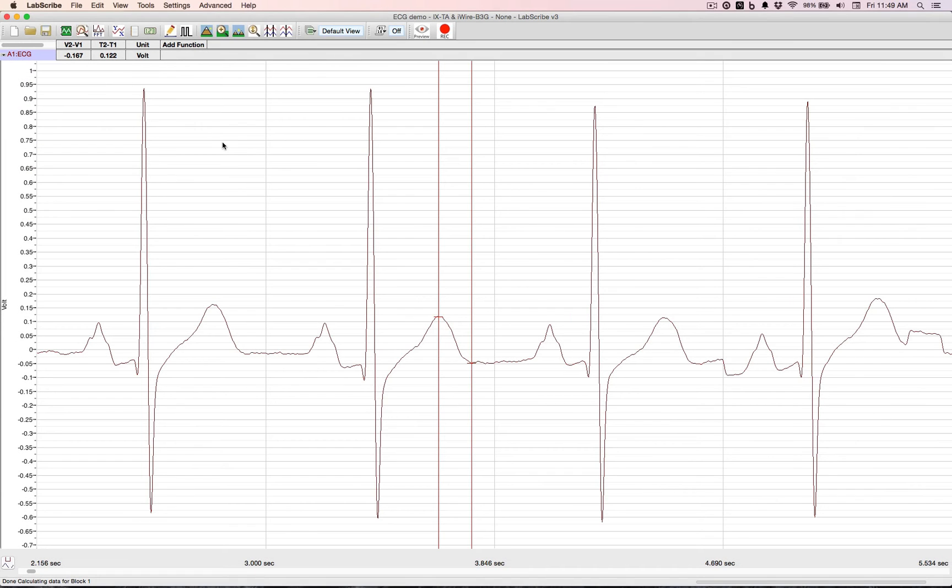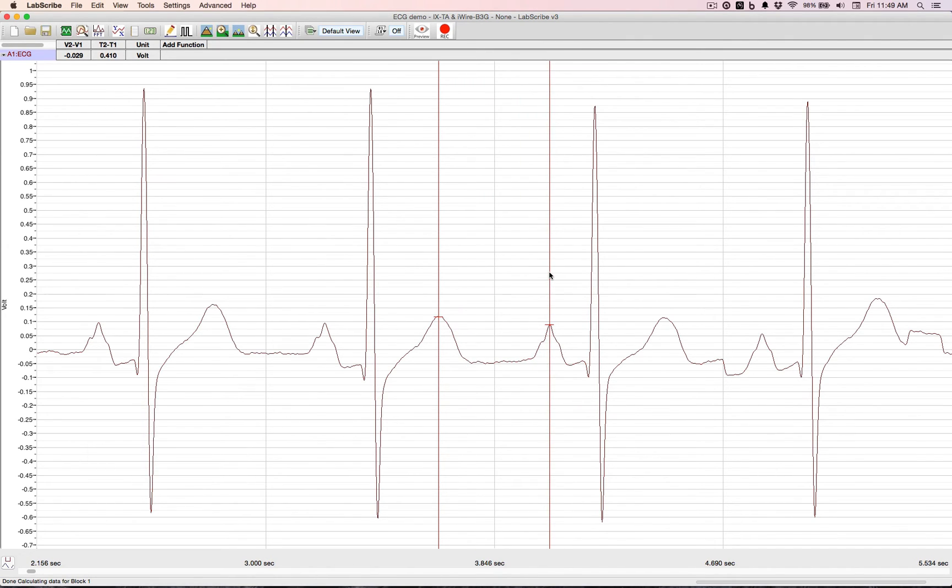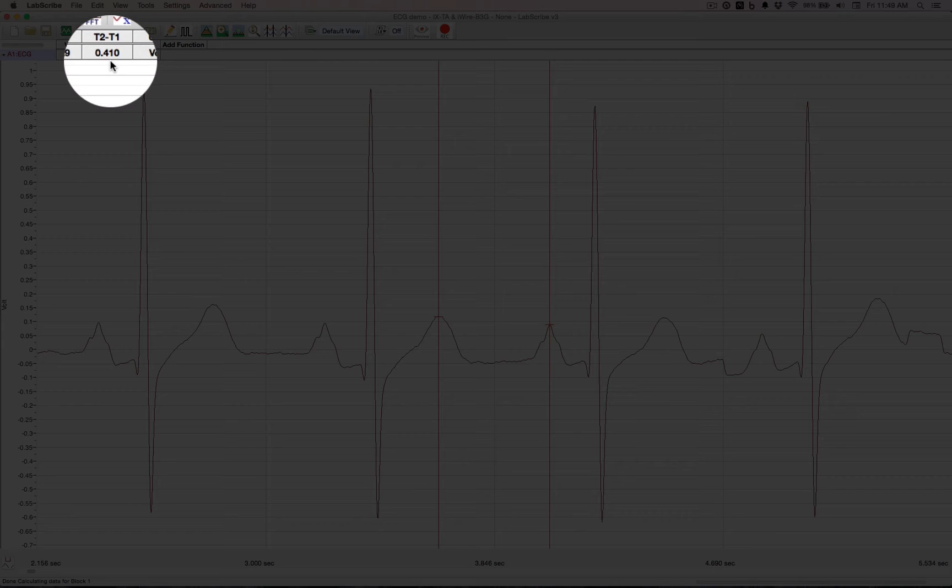Moving the other cursor over to the other P, we can do a T-P duration. That's 410 milliseconds.